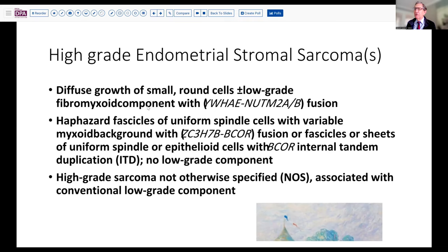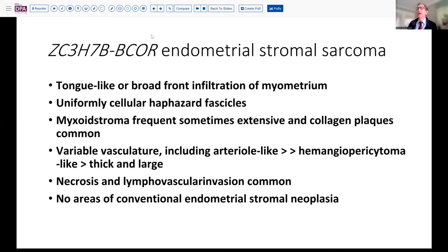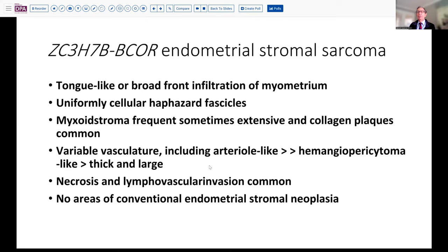Considering this differential, there are a number of things to think about. We're dealing with a curettage sample, so it's possible that we would have missed a low-grade component, and some of those other evaluations might be considered. The challenge with these lesions is that many of the BCOR-related lesions are quite similar — you have an infiltrated pattern, haphazard fascicles, and myxoid stroma with variable amounts of vasculature.